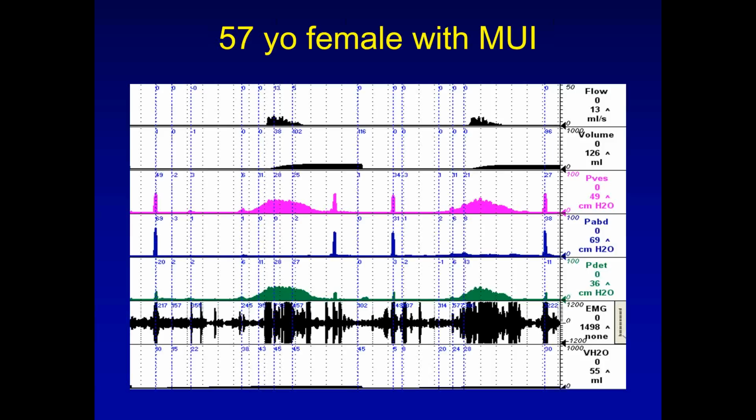There's an easy way. You do another run, a third run. In this case, you tell her, look, the next time you feel the urge to go, just let her rip. Don't try and hold it. If they have true dyssynergia, they won't be able to suppress the EMG. It'll continue to happen. You'll see it look like this another time. On the other hand, if they have pseudo-dyssynergia, they can relax it, and then they'll be able to go. So it's a reproducible detrusor overactivity.